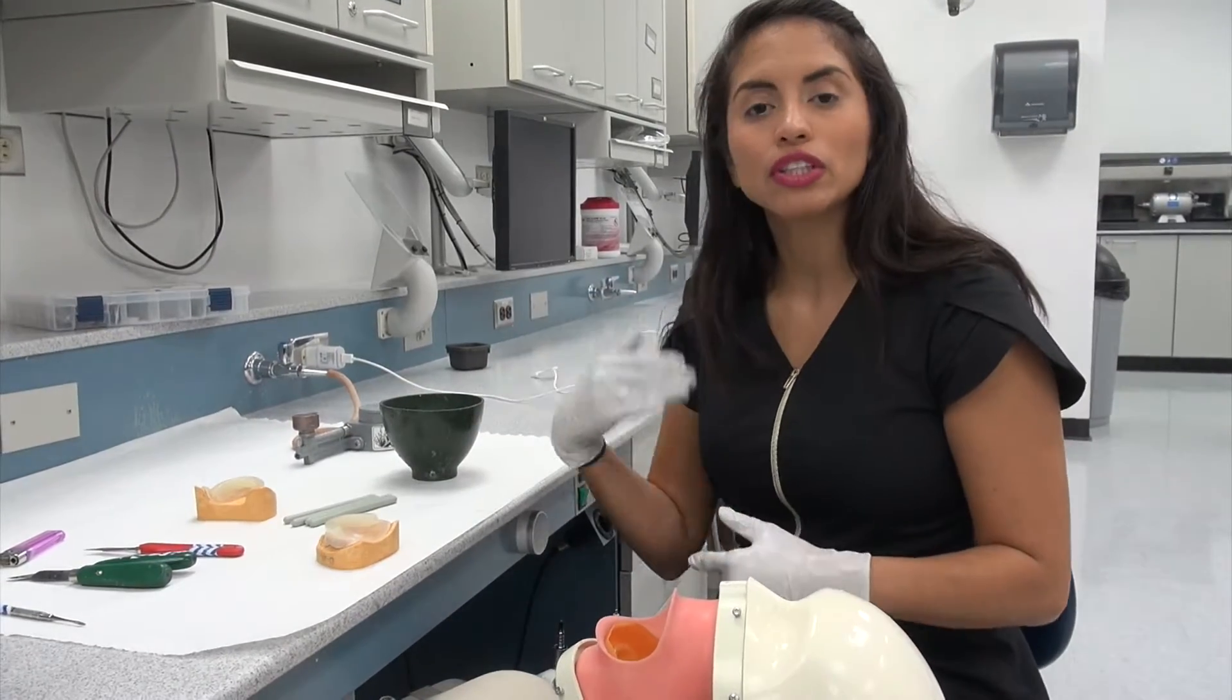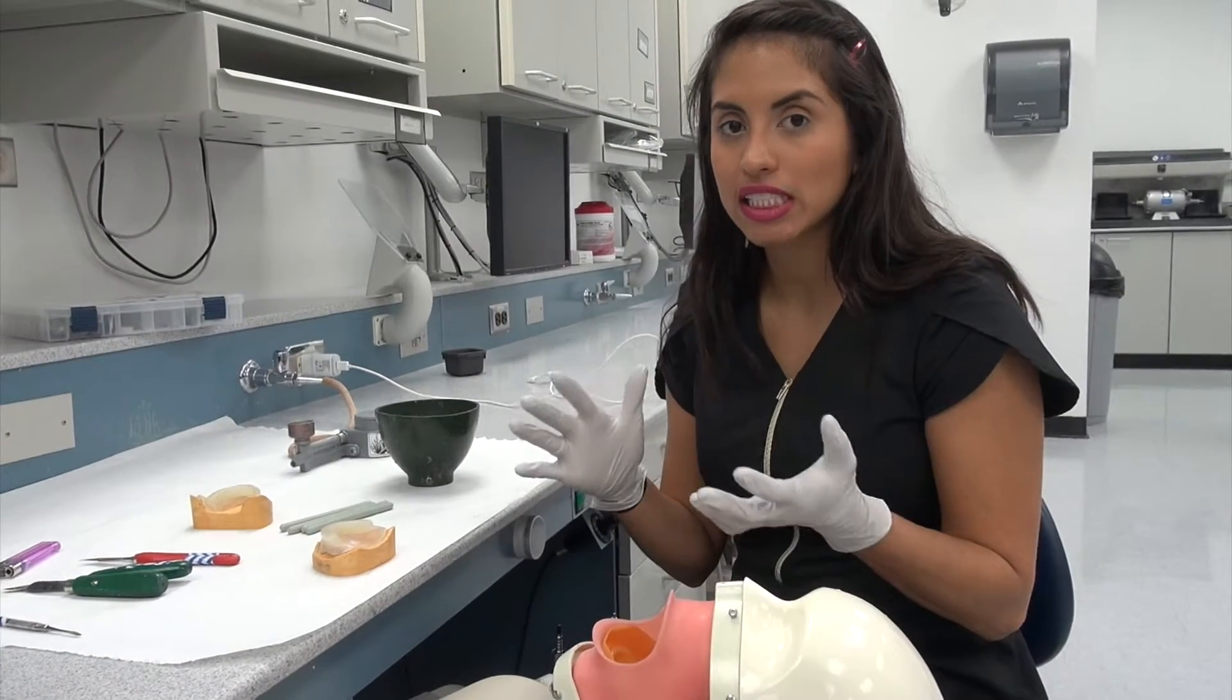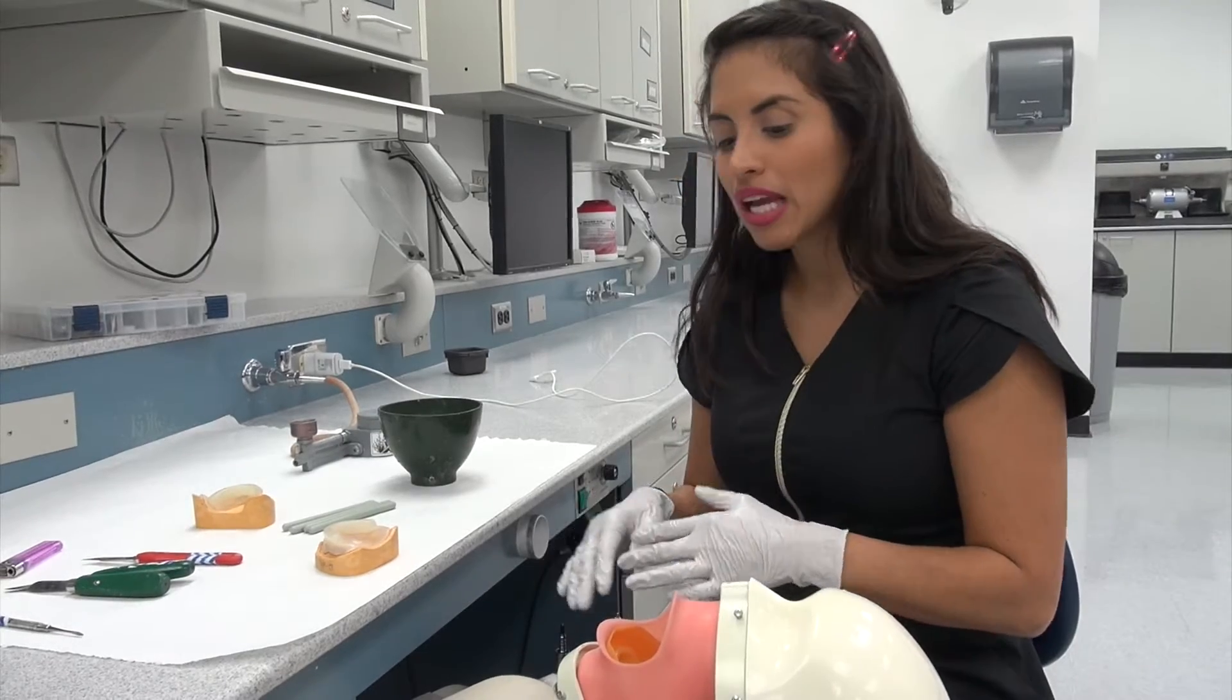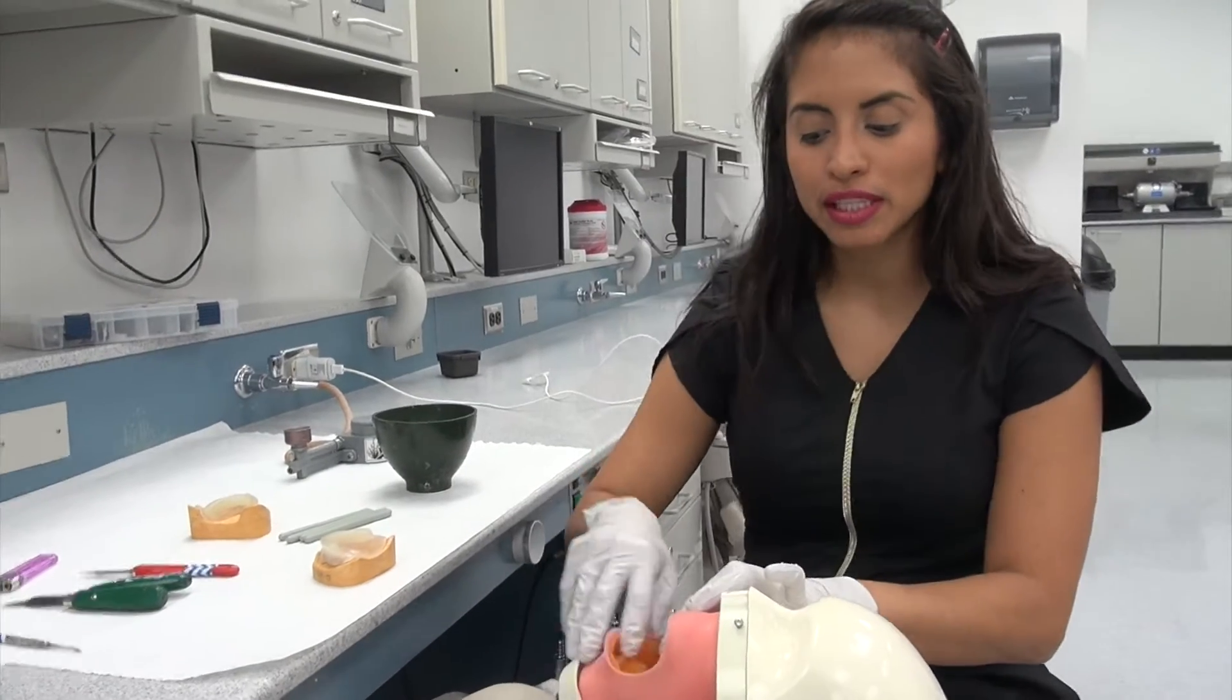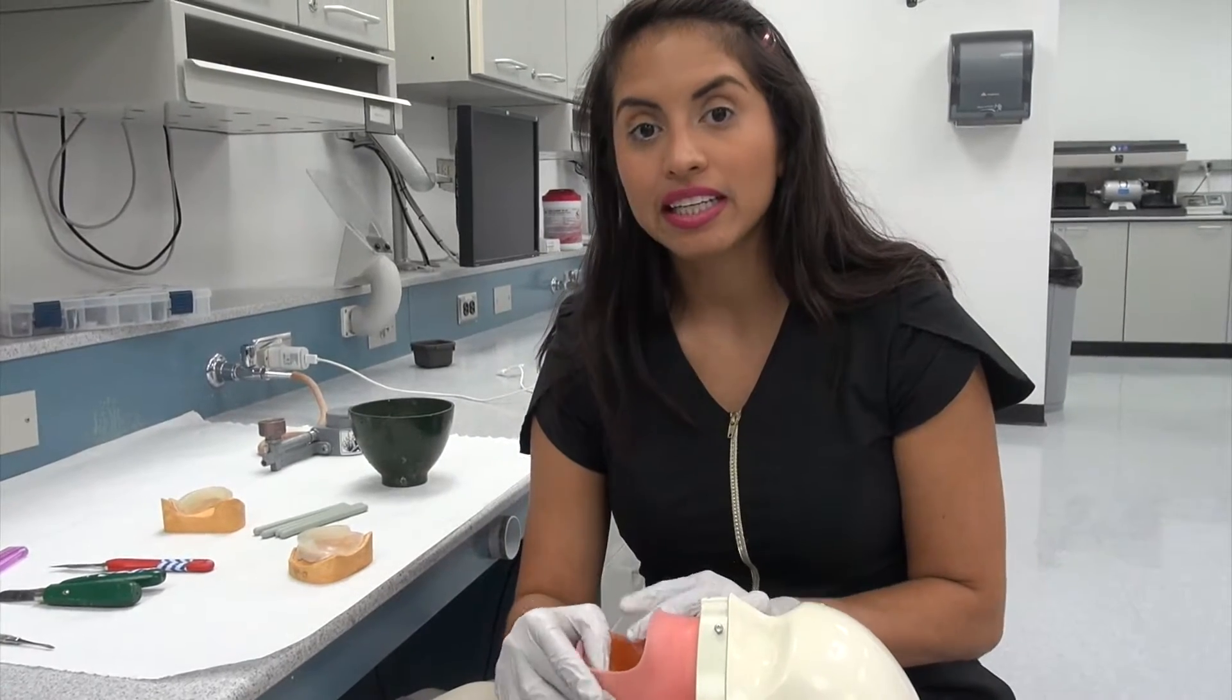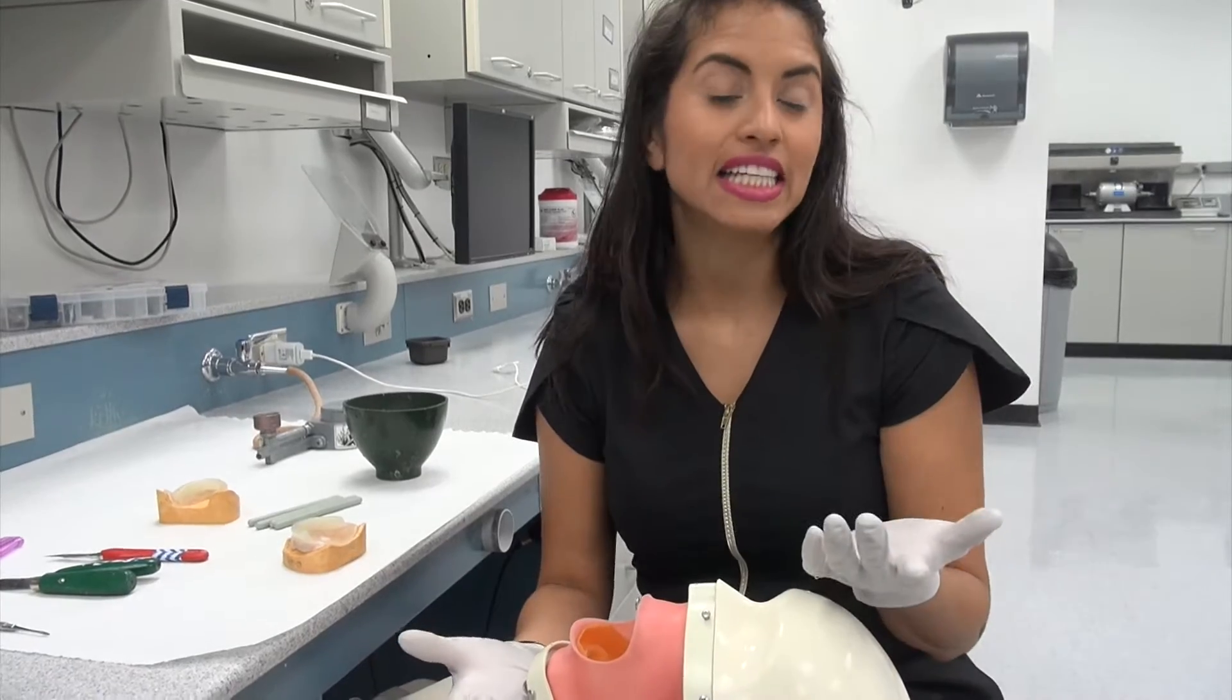I'm sorry, hot water. So let the hot water run for a few minutes until it starts to feel very warm to the touch. And then we're going to put the border molding compound inside and show you how to manipulate the face.